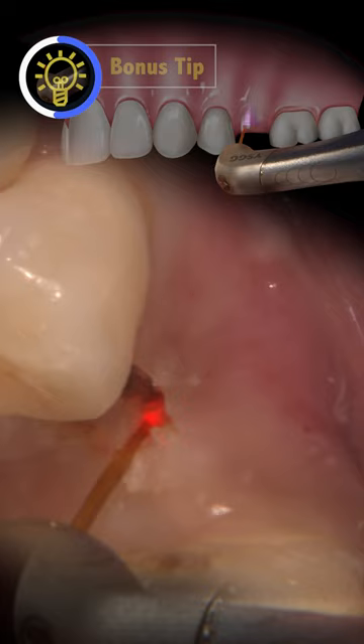The radiation wavelength of this laser allows for great soft tissue coagulation without burning the soft tissue. There are also settings which allow for bone recontouring if bone has grown over the cover screw.